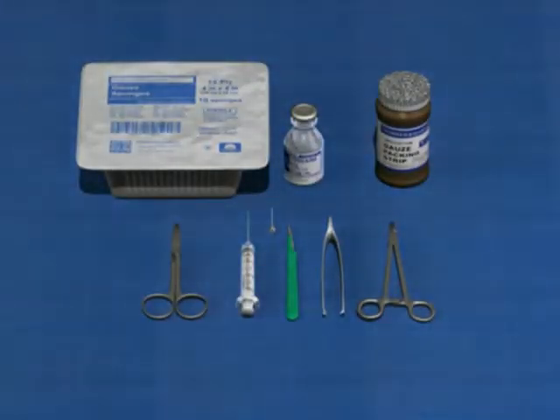The equipment includes local anesthetic, such as 1 or 2% lidocaine, a syringe with a 25 to 30 gauge needle, usually 1/2 to 1 inch in length, since only the skin over the abscess is anesthetized, an alcohol or povidone iodine wipe, 4x4 inch gauze, a number 11 or 15 blade scalpel, curved hemostats, packing gauze, and wound culture materials.